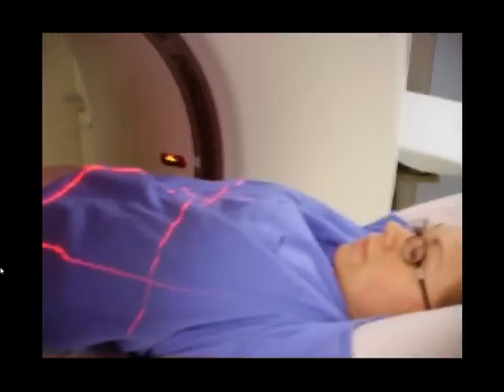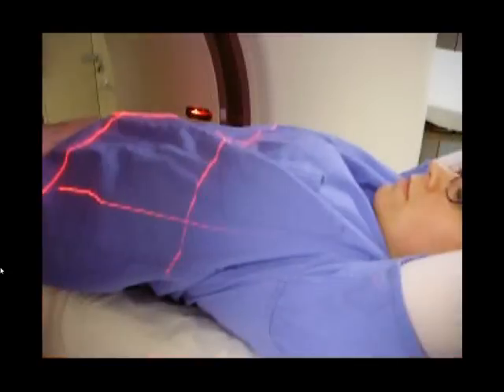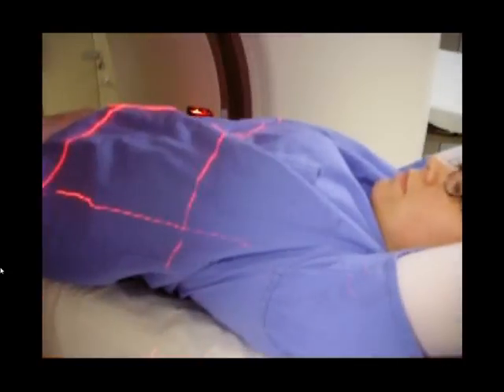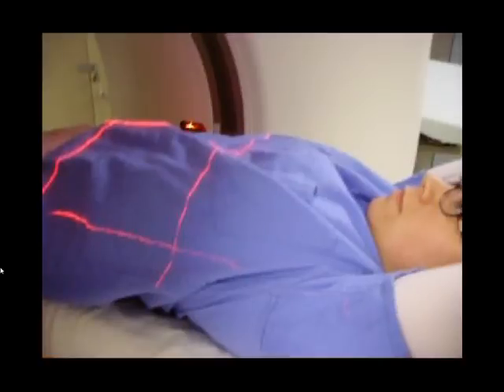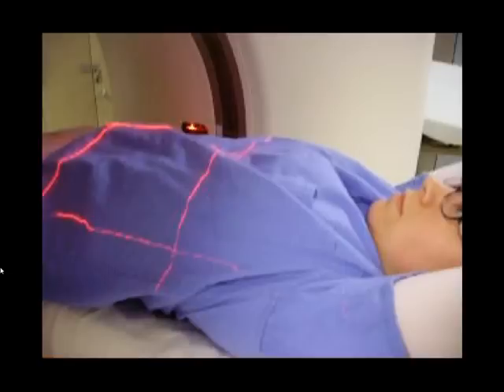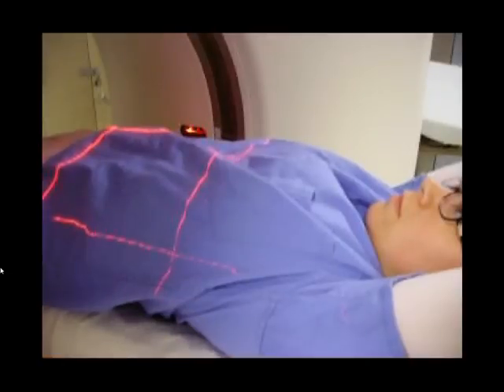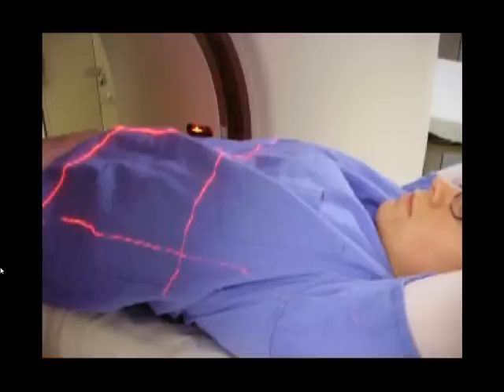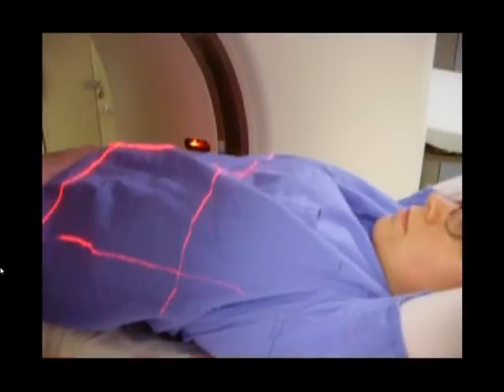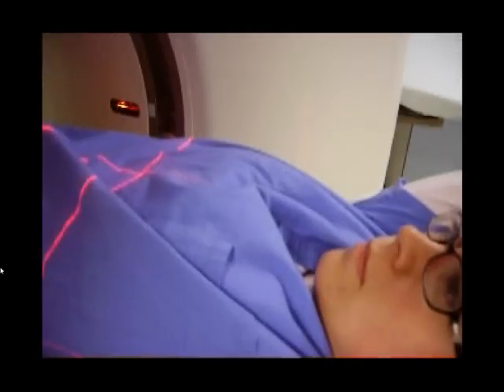Now for a chest CT, it's going to move on up, and it's going to go at the suprasternal notch. Your sagittal line will be at the mid-sagittal plane, and your coronal line is going to be at your mid-coronal plane. So now we've got that line moving up. Get a nice view of it going up and getting into position.